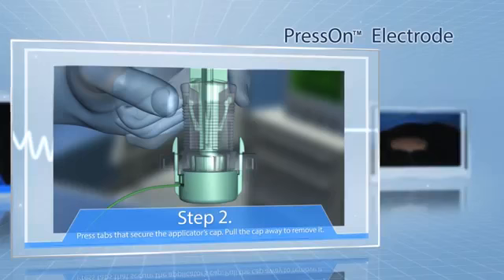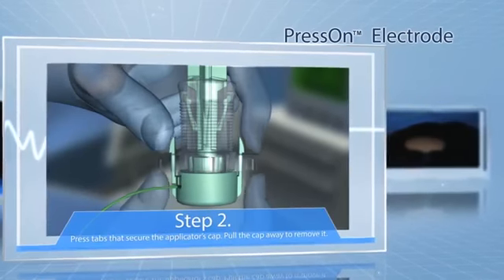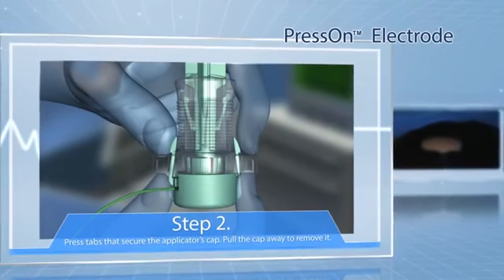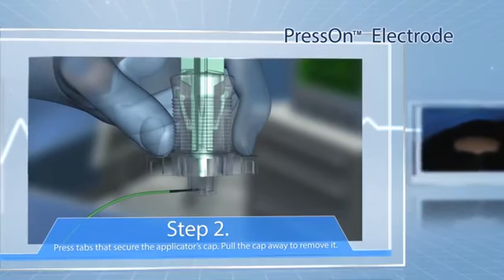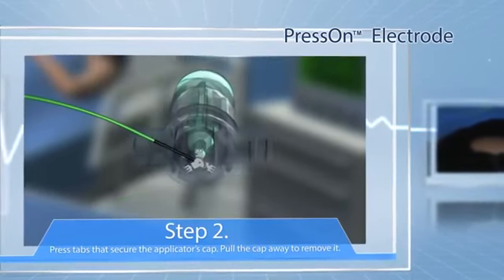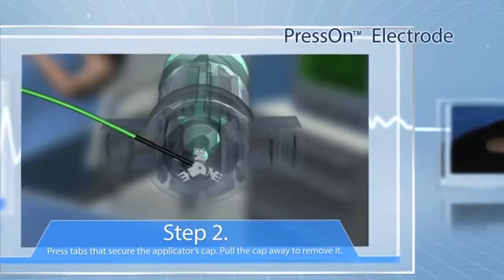Step 2: Using your thumb and index finger, press tabs that secure the applicator's cap. Pull the cap away from the applicator to remove it. The press-on electrode is now visible and ready to be launched. Discard the cap.